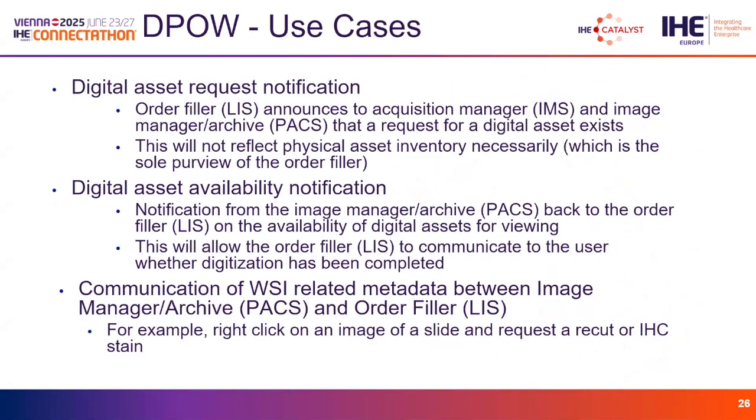Digital pathology order workflow. This is an effort by a few vendors, as well as myself, to really understand what the gaps are that need to be filled to make the holistic set of profiles useful in a vended product. One of the key elements is that we need to be able to recognize when a digital asset has been created and when one needs to be created based on some user interaction. And so these are the digital asset request notification and digital asset availability notification.